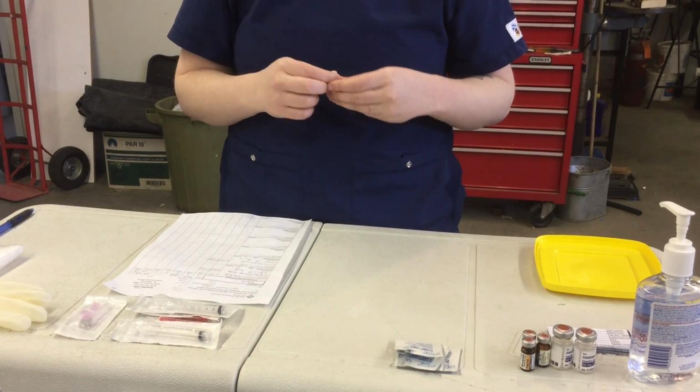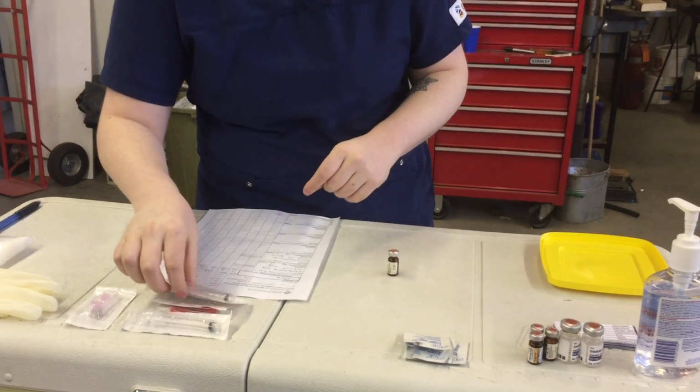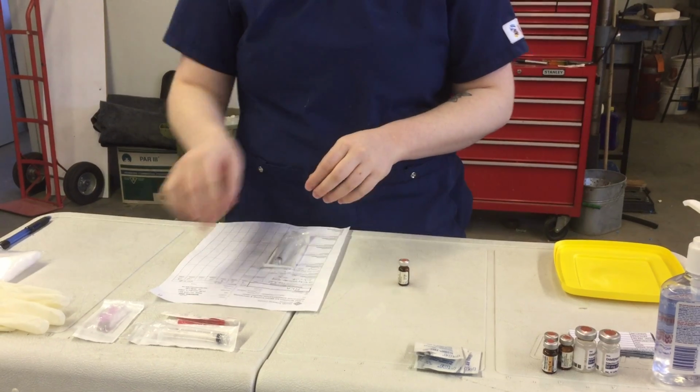So after I've just gone over all of that, I'm just going to wash my hands and gather my correct supplies. So I'm going to be using a 3 ml syringe to draw up 1 ml of the solution, so that's good.